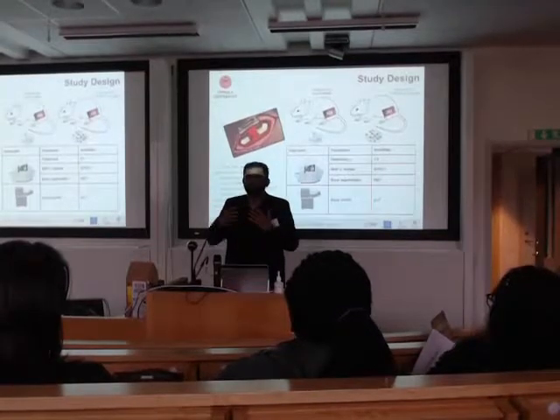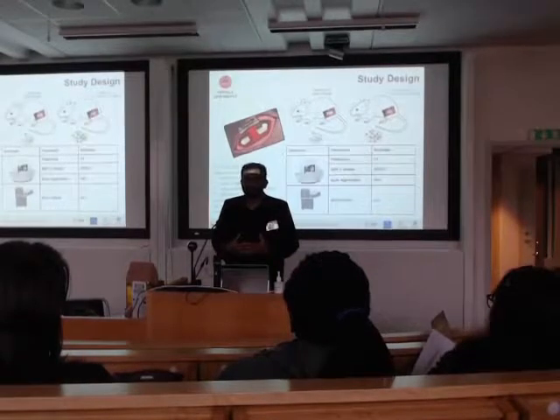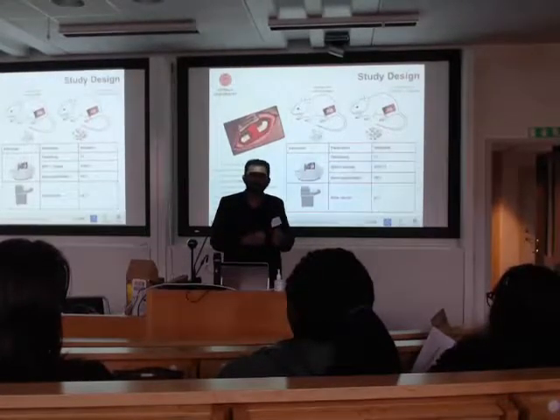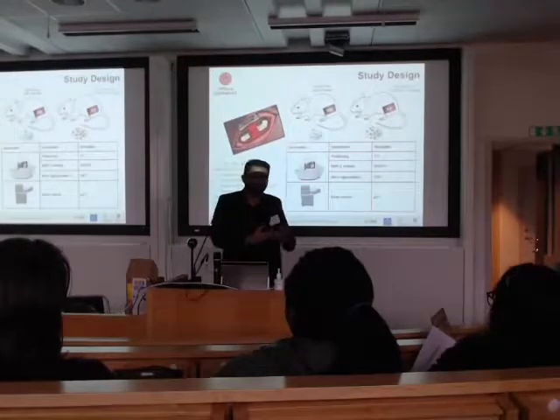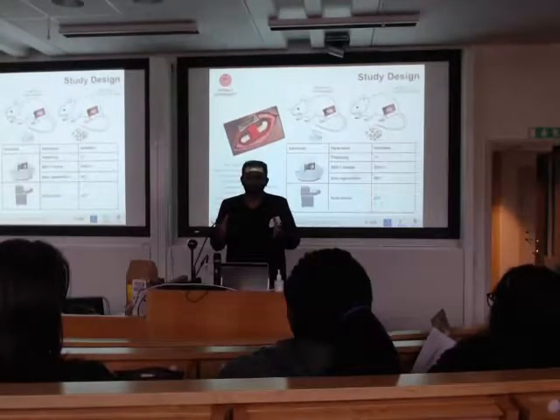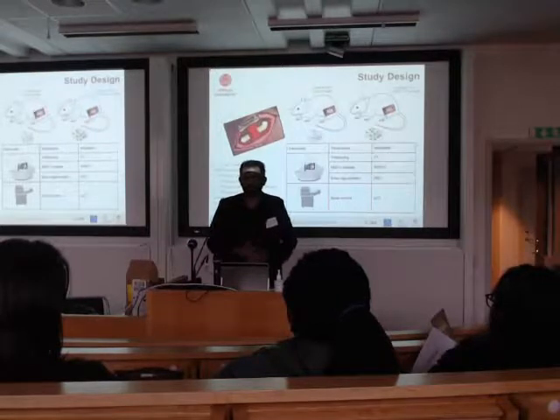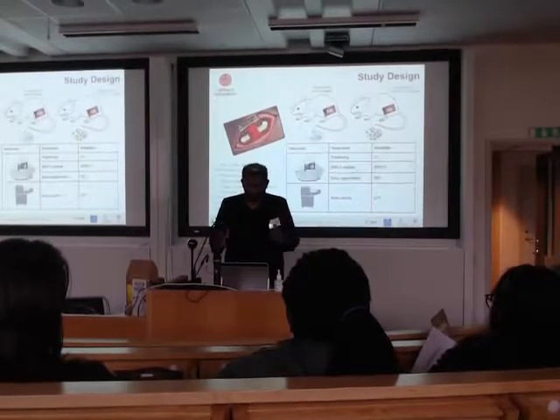And to follow that, we use radio labeled fluorine. If you know, fluorine plays an important role in bone regeneration. So what we did is we just radio labeled the fluorine. And if the bone is regenerating, this radio-labeled fluorine will be taken up at the site of fracture, which can be detected by PET. And the most obvious thing to see the final output is to see if the bone is actually growing or not. To visualize that, we used micro-CT.